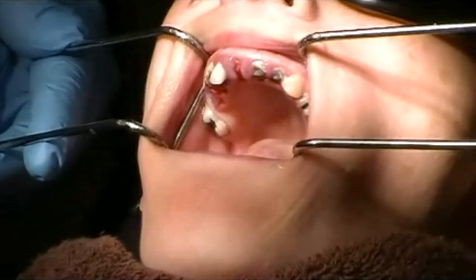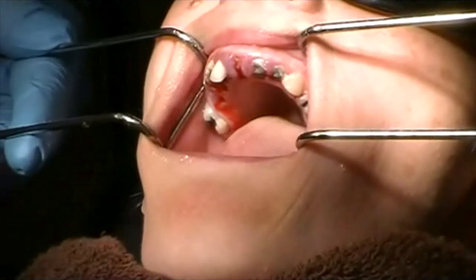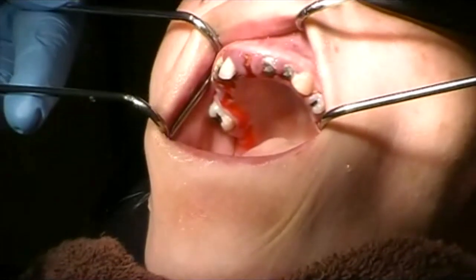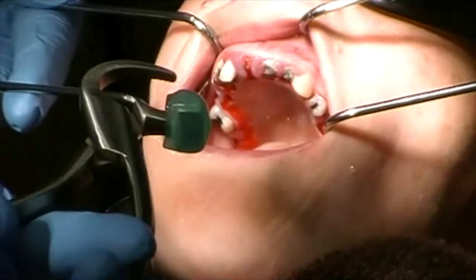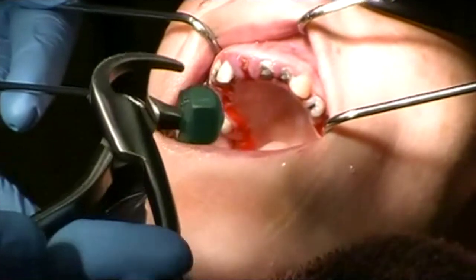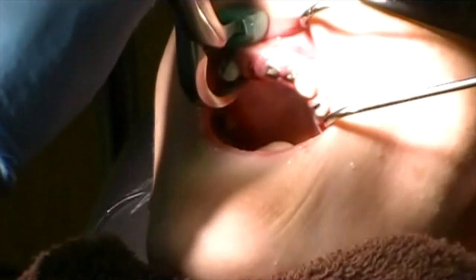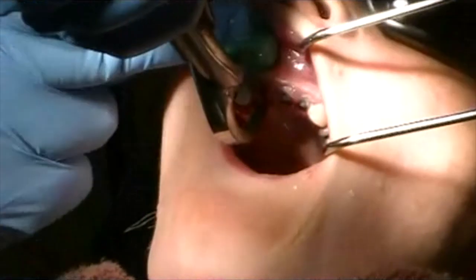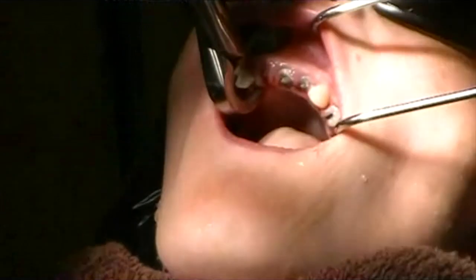For demonstration, let's start with the anterior teeth. We're going to take the flattened portion of the physics forceps and place it as far subgingival on the palate as possible. We'll start with this lateral just for demonstration purposes and try to put the bumper as far lingual as possible.